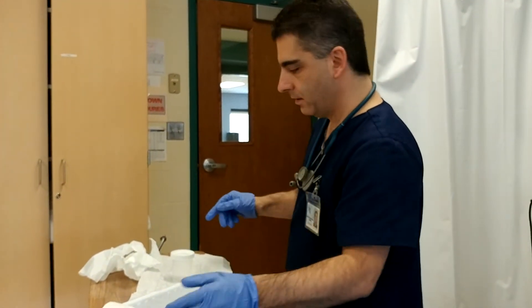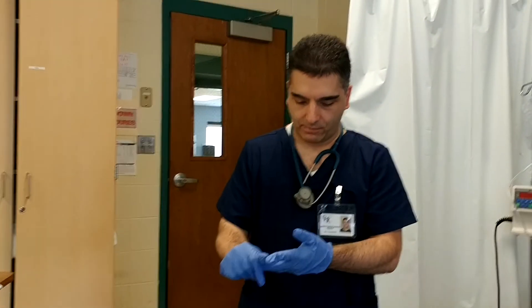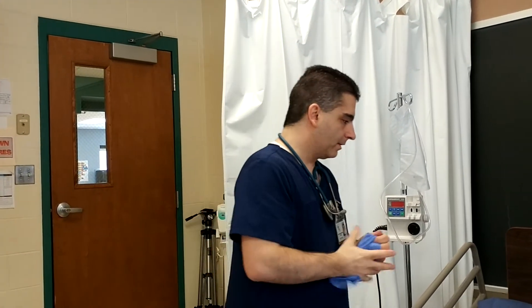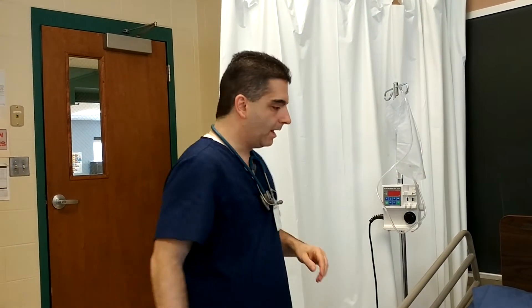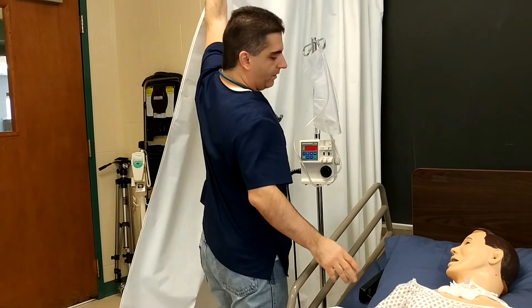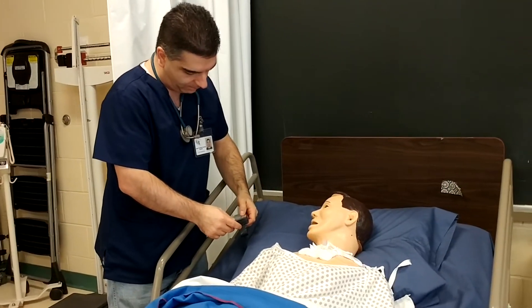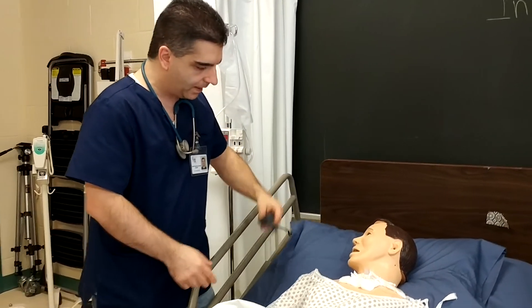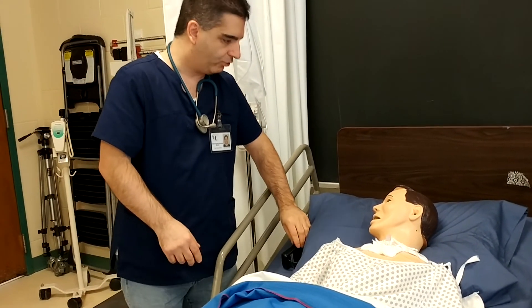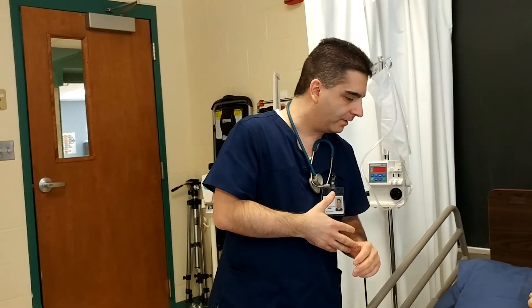Clean up my mess here. The mess is cleaned up and the specimen has already been sent down. Mr. Jones, how are you feeling? Wasn't too bad? I'm going to give you back your privacy. I'm going to put your bed back down. Here's your call bell. You should have the results pretty soon, so we'll go ahead and finish up. Your doctor needs the results.